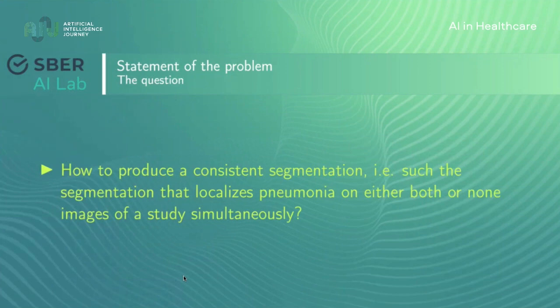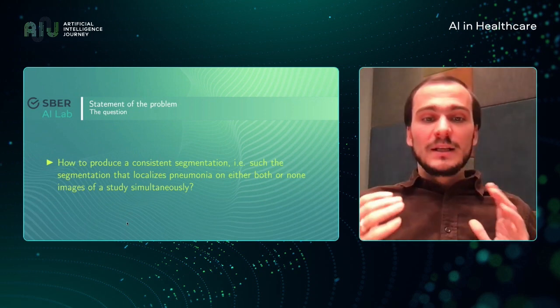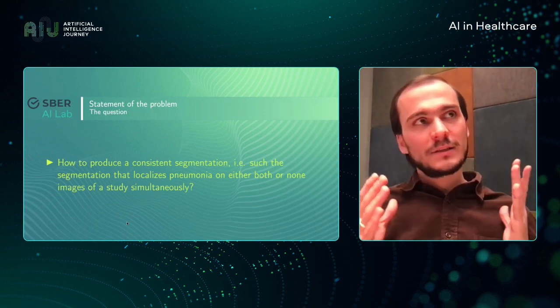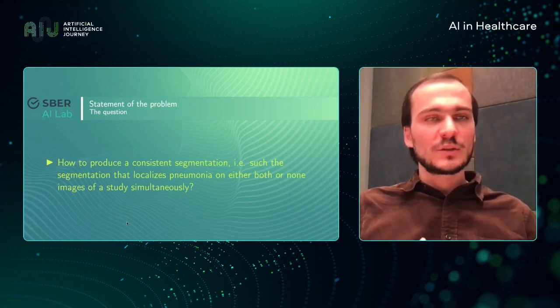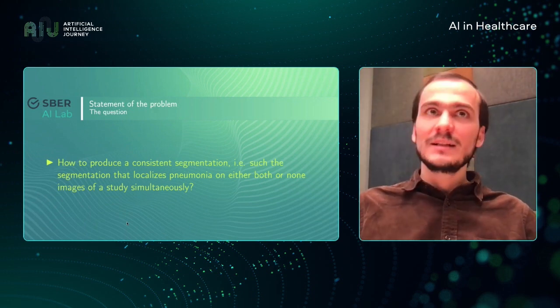So this means a problem for doctors from a clinical point of view, because X-ray study, from what doctors say, is a study with a low capacity, and sometimes doctors do the following: they analyze the frontal image, and if they do not see or they're doubtful about pathology, they use the lateral view.